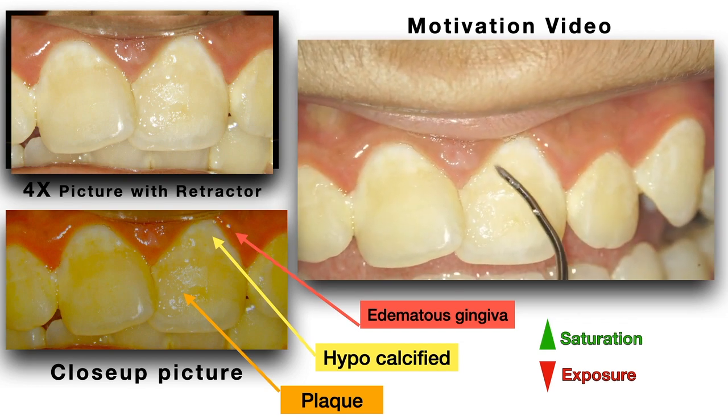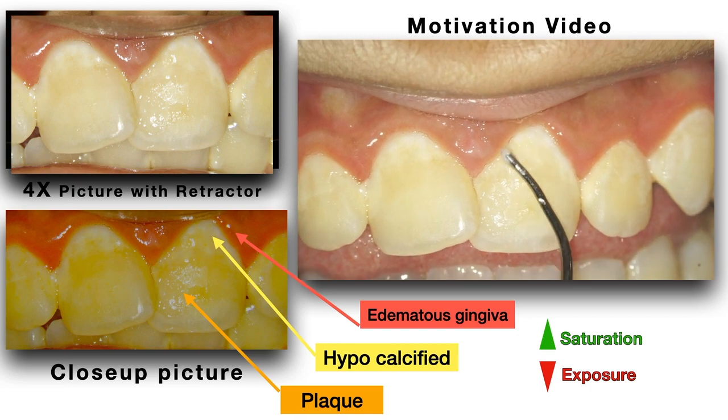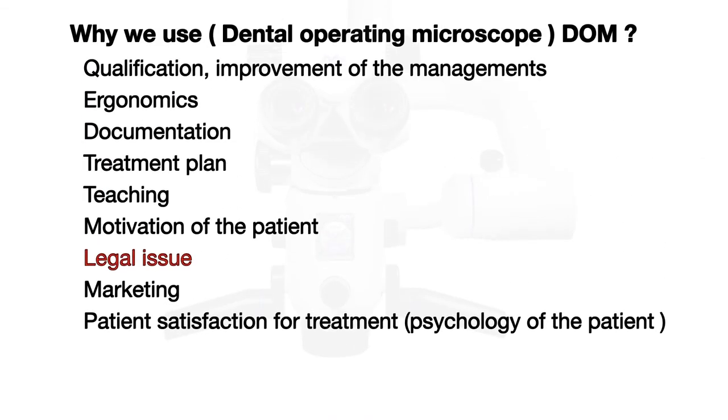So it's very, very easy to motivate the patient if you have a dental operating microscope. Another thing is the legal issue. Our country is like other countries. Sometimes people complain about something that maybe was not clear to them.